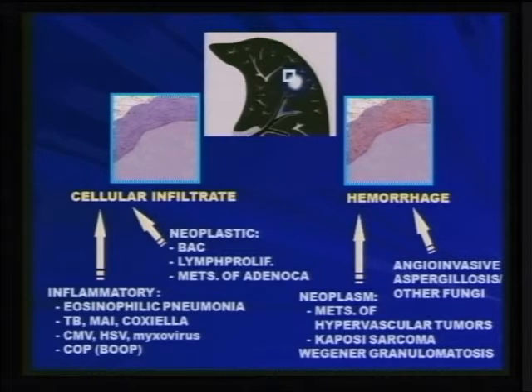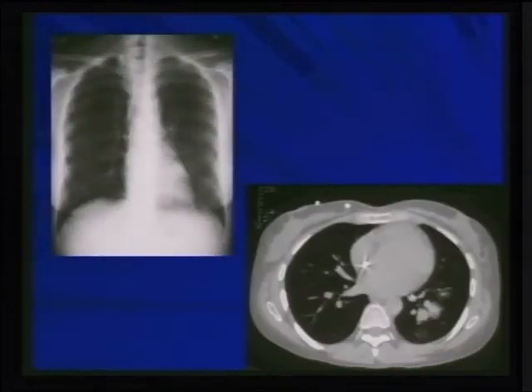So the point is that there are multiple causes of halo sign. But in the right host, especially in the immunocompromised host, you have to think about aspergillosis, especially invasive aspergillosis. And this is an early example of halo sign in a patient with invasive aspergillosis.